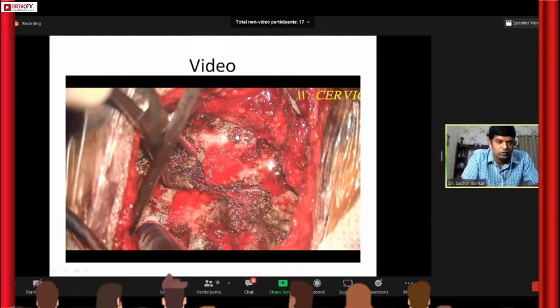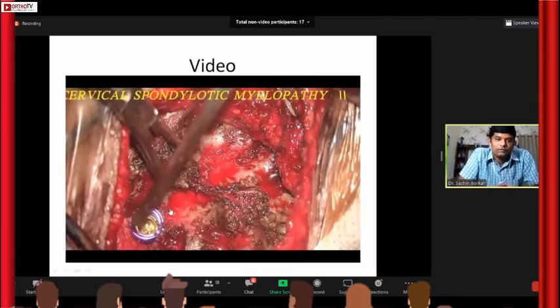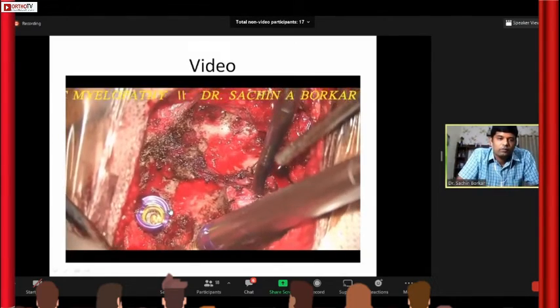This is what the usual adult lateral masses take, and usually polyaxial screws, so that we can manipulate the screw heads in case of problem. So after all these steps which I just described, we put the screw.